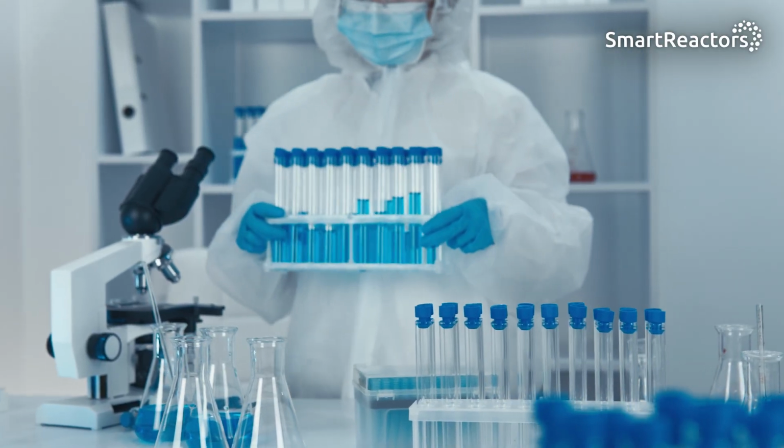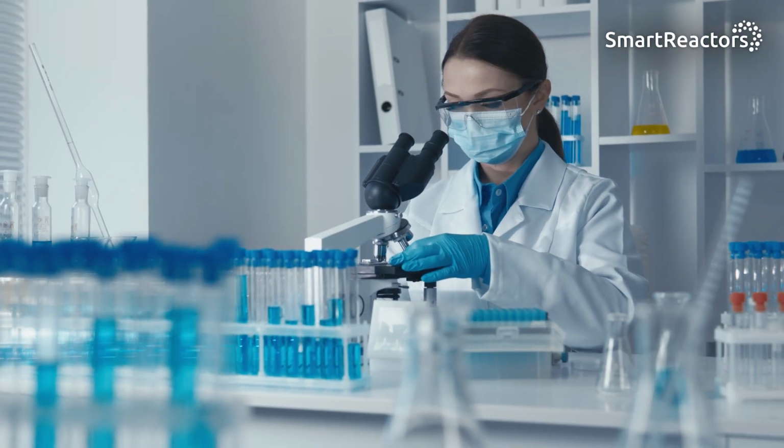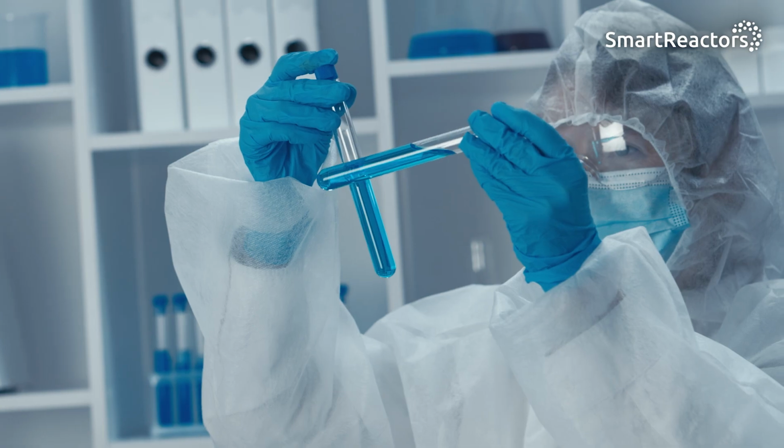So depending on the materials that have to be coated, one has to look at the chemical compatibility between the solvents and the substrates. The scale of the application process needs to be planned in pretty early so you understand your floor footprint, particularly in your clean rooms, and you have to understand the time it takes to process a lot, the level of automation and the level of investment. Clean room compatibility is a requirement for all equipment and all coating processes, so this has to be understood very, very early when selecting a coating.